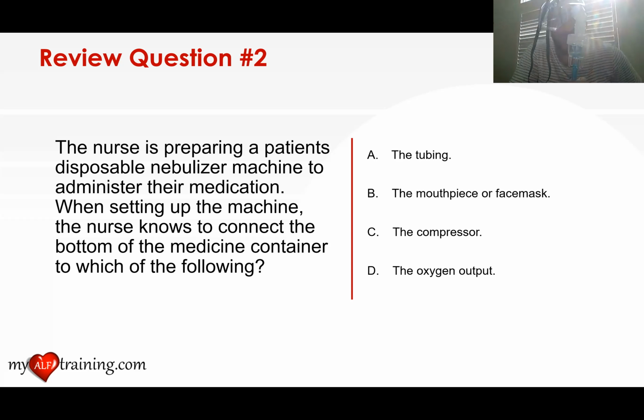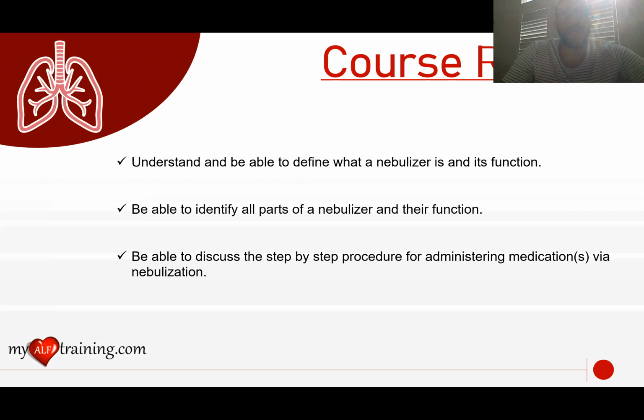Very easy, the tubing. And the tubing then runs to either the compressor or the oxygen output. But the bottom of the medicine container / nebulizer cap connects to the tubing, right? Right. All right.